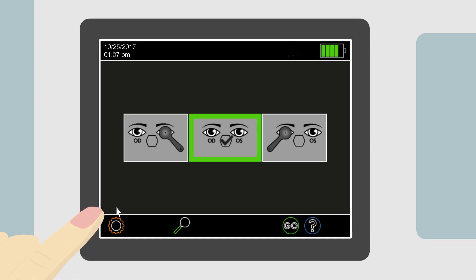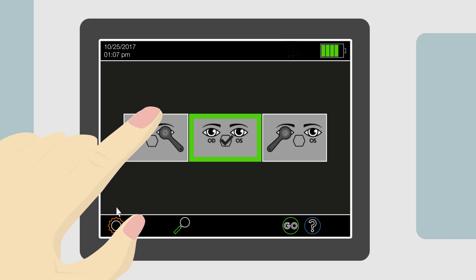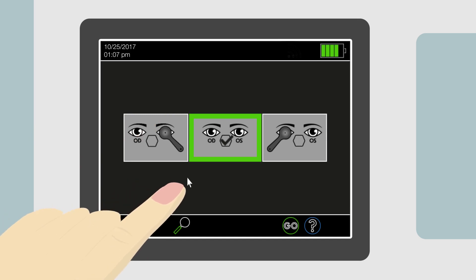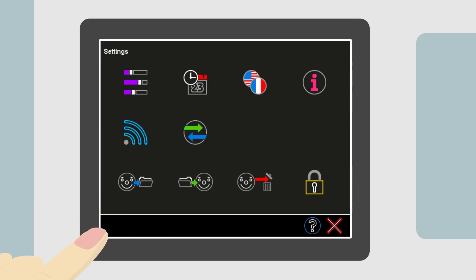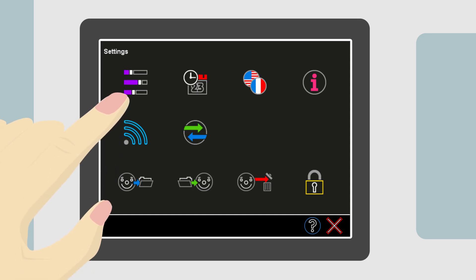Simply touching a button will activate the selection. If the device does not respond to the touch, the touch may have missed the button. The cursor arrow will show where the device sensed the touch. Now touch the settings button and then the button for the basic settings on the top left.